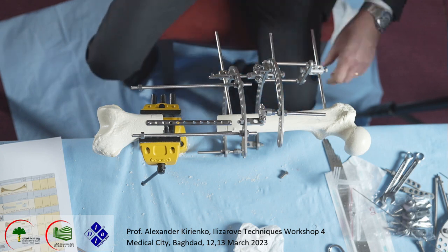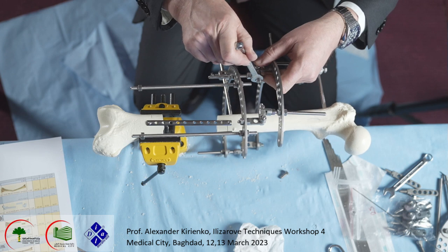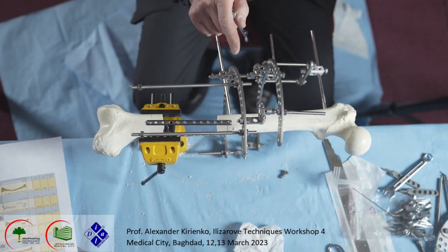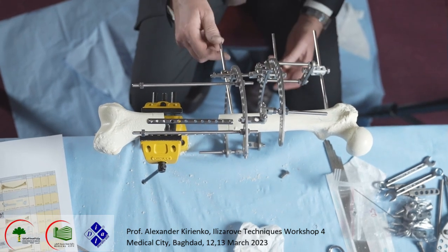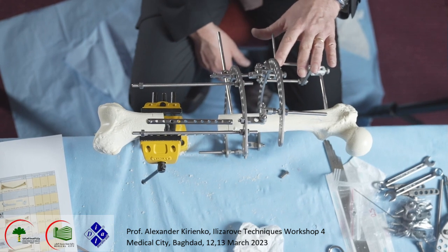Okay. Now I put this third rod and later we put the fourth, because like I said, for better stability we always have four rods for connection. Now we stabilize it. Obviously we should continue, because there is not enough stability now.